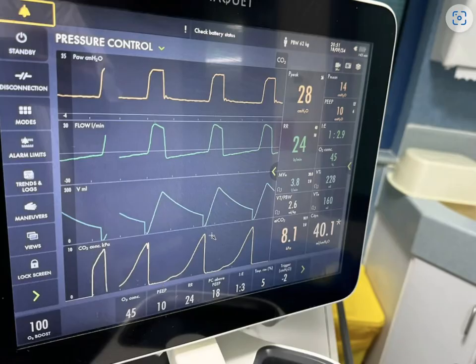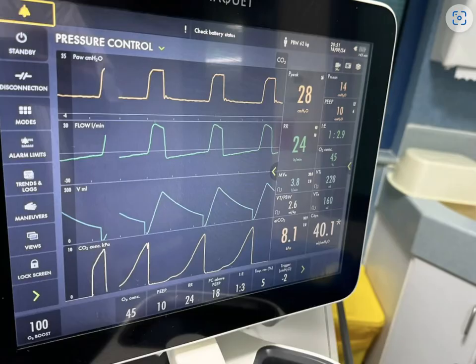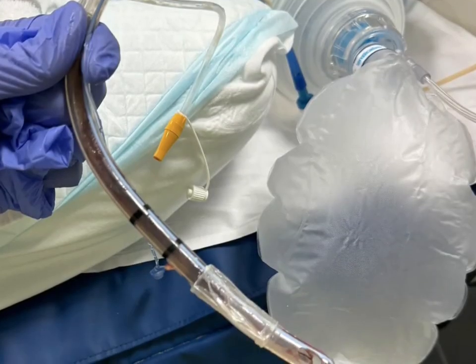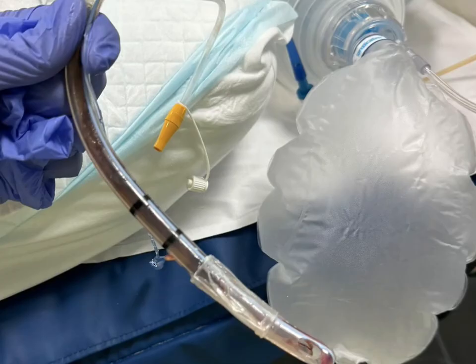This is what we call the shark fin waveform. Along with the limitation in flow, the persistent flow at end of expiration, and this shark fin pattern — altogether these indicate severe obstruction in the airways. In this patient, what happened is there were lots of secretions plugging the endotracheal tube. You can see that inside the tube here. The tube was changed and everything resolved.